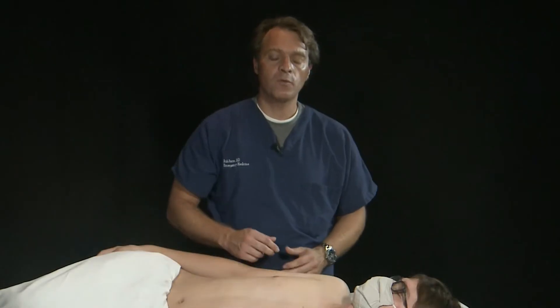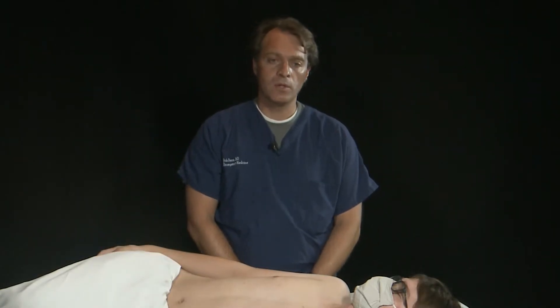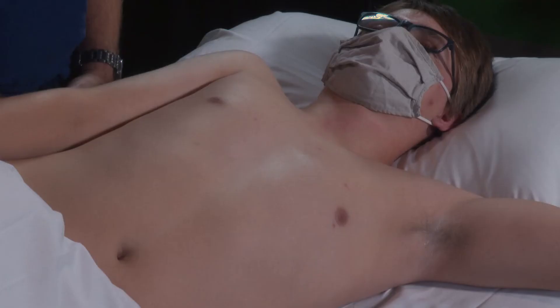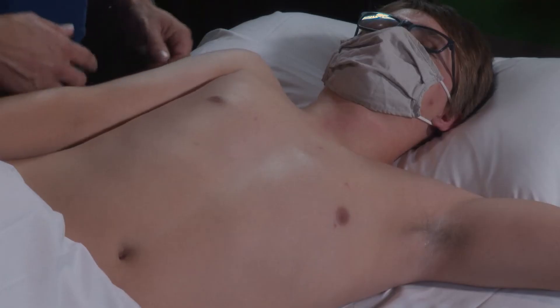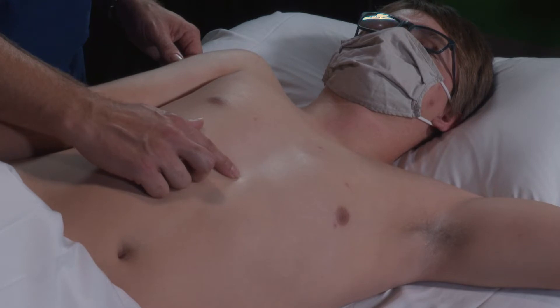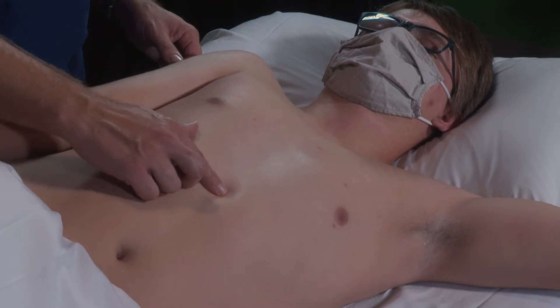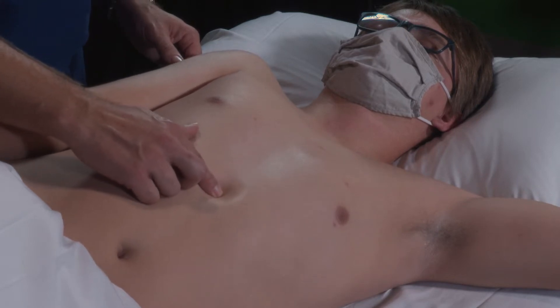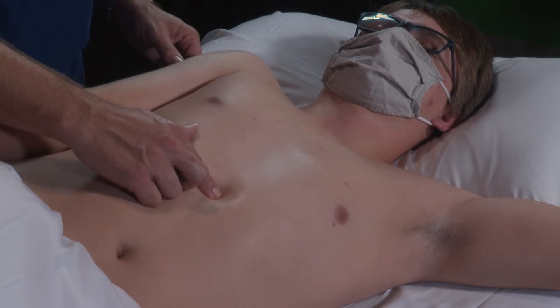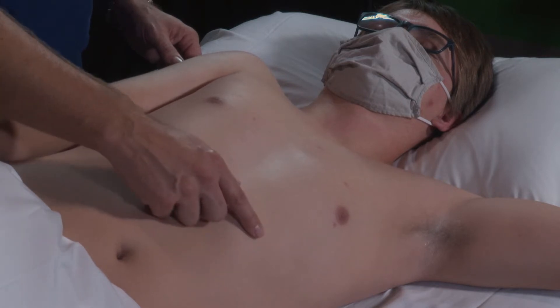After we've obtained our apical windows, we're going to look at our subcostal windows. Our subcostal windows are obtained by placing the transducer immediately inferior to the xiphoid process, and we're going to have the marker dot pointed towards the patient's left flank.